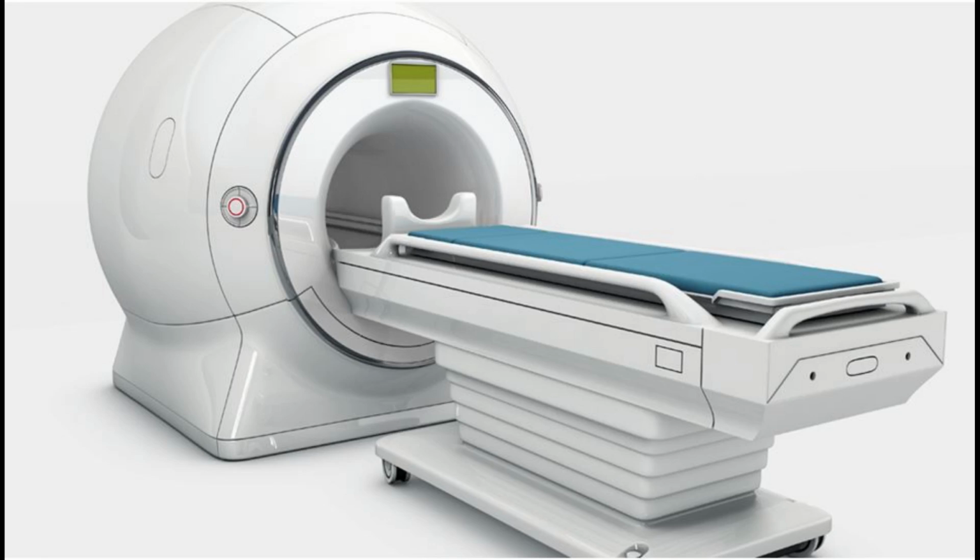Musculoskeletal applications in the musculoskeletal system include spinal imaging, assessment of joint disease, and soft tissue tumors. MRI techniques can also be used for diagnostic imaging of systemic muscle diseases including genetic muscle diseases.